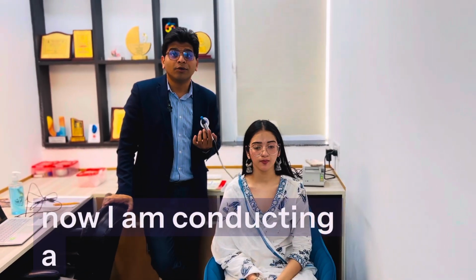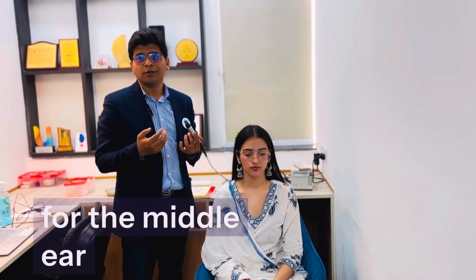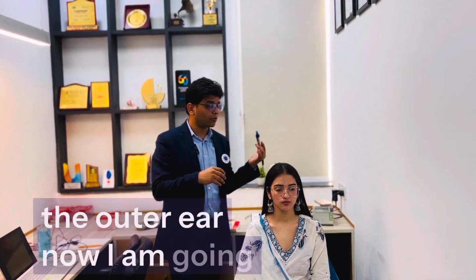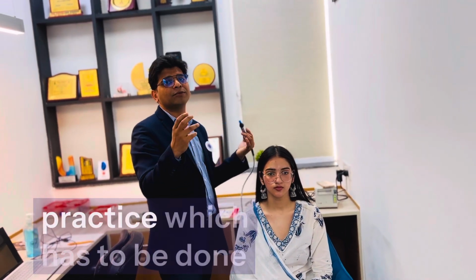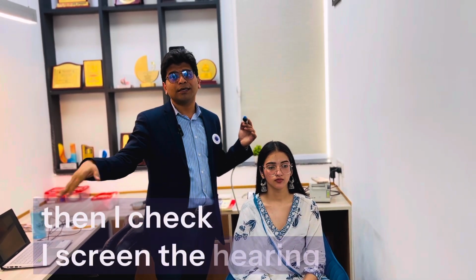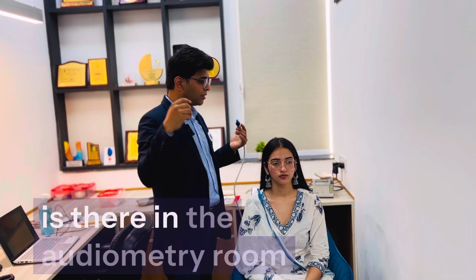Now I'm conducting a tympanometry, which is the test for the middle ear. So with otoscopy, I have seen the condition of the outer ear. Now I am going to see the condition of the middle ear. This is actually not a standard practice which has to be done, not a thumb rule, but this is something that I do. I evaluate the outer ear, then I evaluate the middle ear, then I screen the hearing loss, what type of hearing loss it is, and then we conduct audiometry, which is there in the audiometry room.